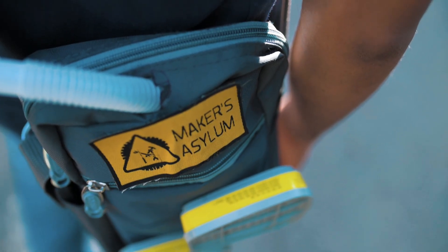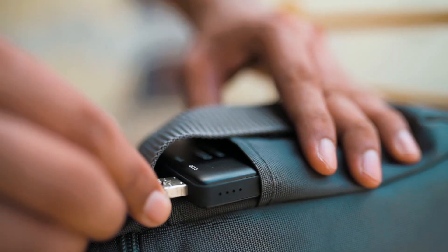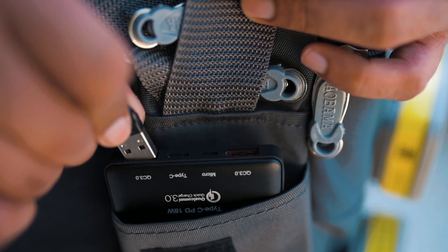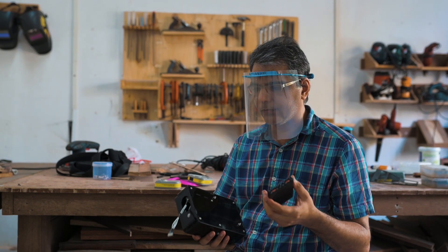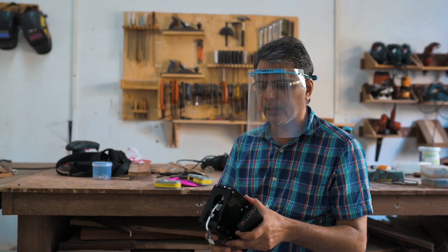One other thing we did was think about how these devices will be powered. Usually most PAPR devices are powered with proprietary battery systems, which makes it very difficult to use in a wide-scale environment or in remote areas. So we came up with the idea of using regular power banks which are easily available. In case you don't have the one that comes with the device, you can put in a different one, making the system much more flexible and adaptable.